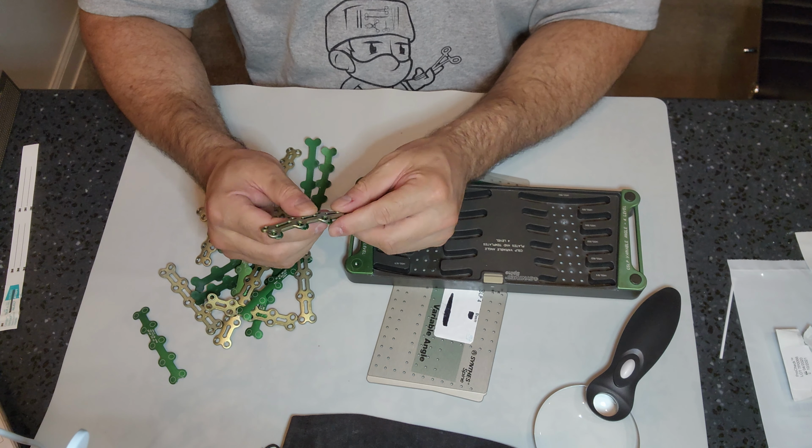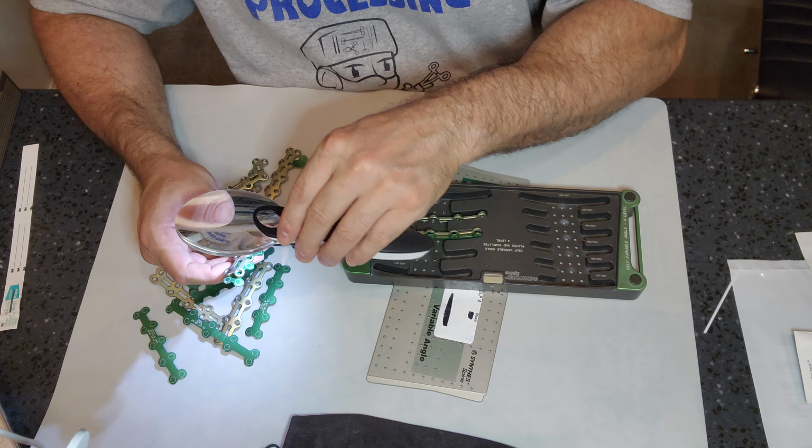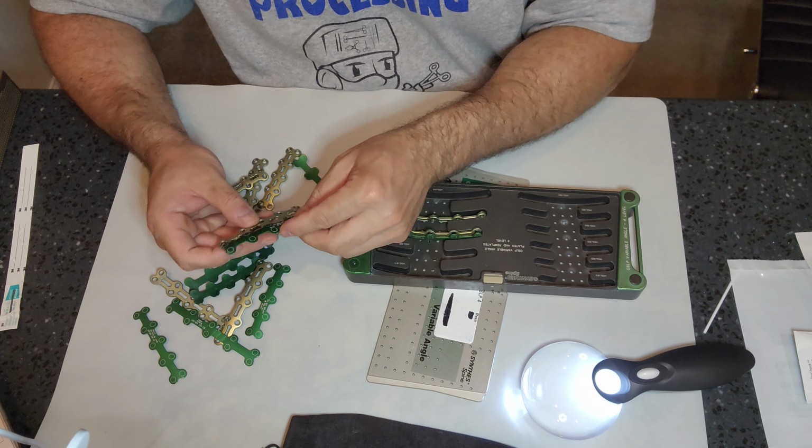Like I said, this is an easy tray, not very difficult, but you want to inspect your instrumentation, inspect your trials. Once you marry it up, get that item number. This is 89. Now the trial has a 1892, but that's a 350, that's a 450. Okay, 189. Continue to do this process until your tray is complete.